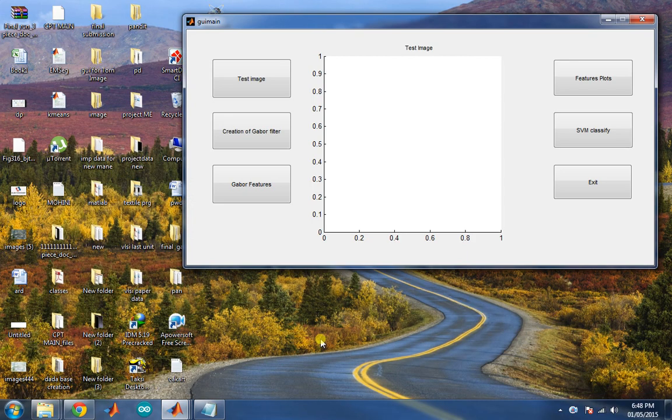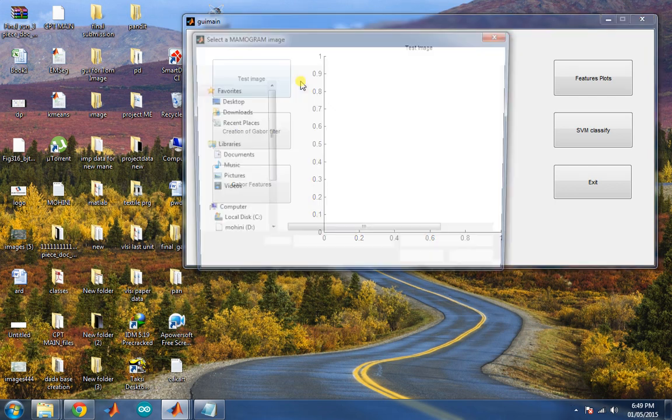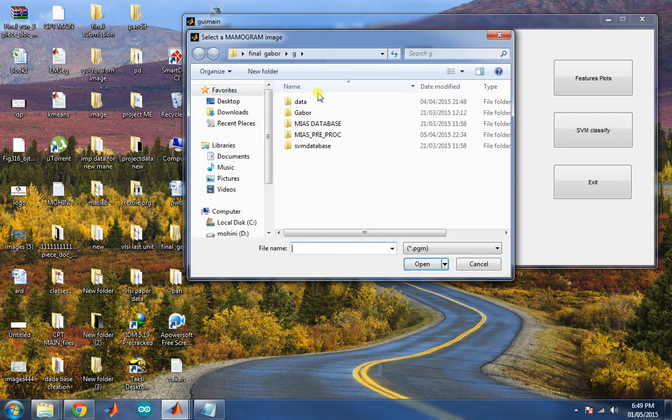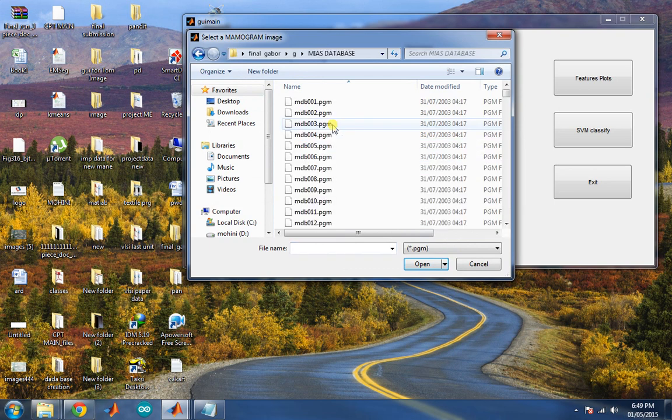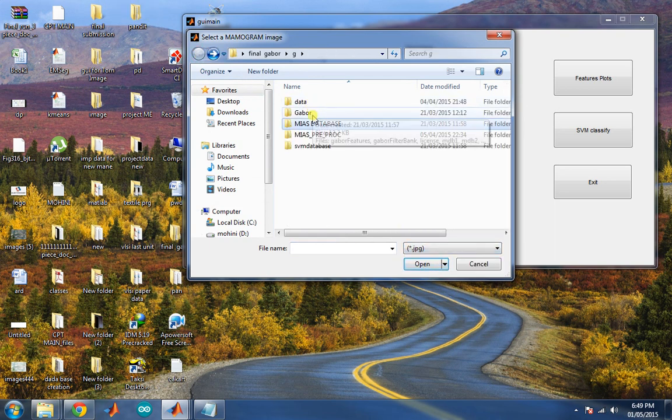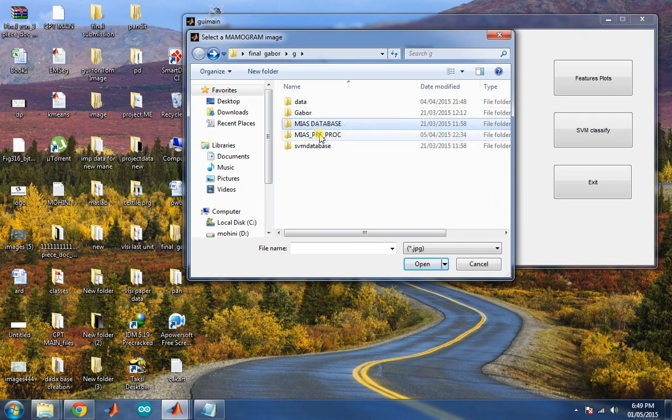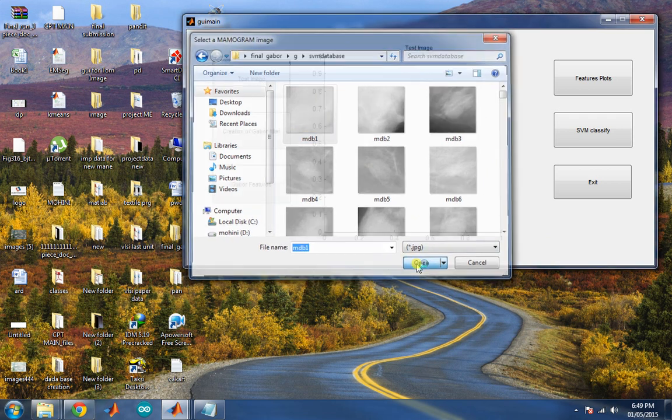This is the GUI for the project. First select the test image from your database. The image should be in JPG format. Select any one image.